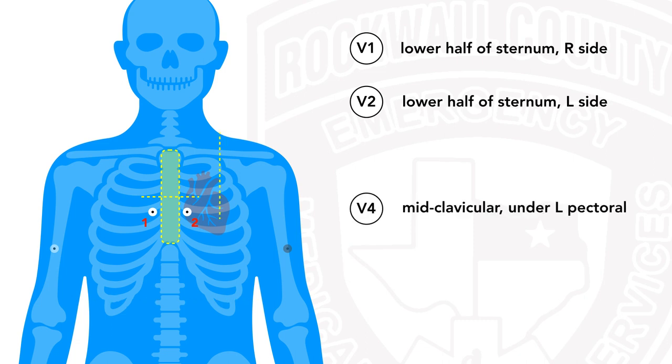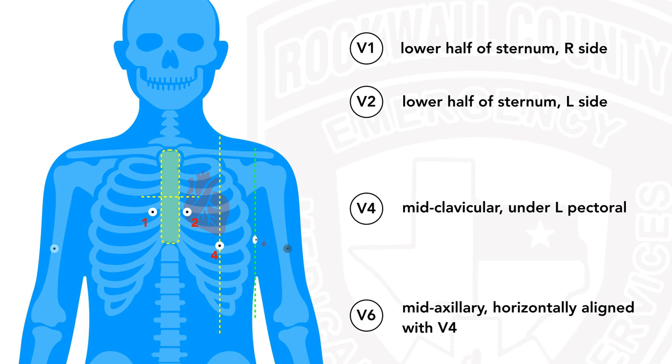We're going to skip V3 for a moment and go to V4. V4 is going to be mid-clavicular — splitting the clavicle and left side of the chest in half with a vertical line — and we're going to place V4 right under the left pectoral muscle. Some individuals, male or female, may have a lot of adipose tissue there. If they do, after explaining what you're doing and why, just use the back of your hand to gently lift up that adipose tissue and place the remaining leads. We're going to skip V5 and move to V6 to establish a landmark — that's mid-axillary. Lift up the left arm, split the left flank in half with a vertical line, and place V6 along the same height as V4.